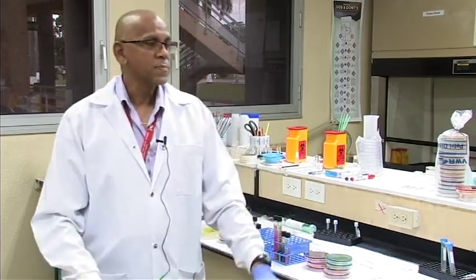In the microbiology lab, infections are identified in several ways. The gold standard is culture, but sometimes culture may not work, depending on the etiology. You may have to resort to molecular biology or DNA testing for identification of such pathogens.